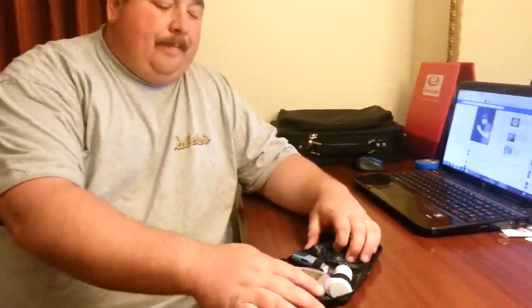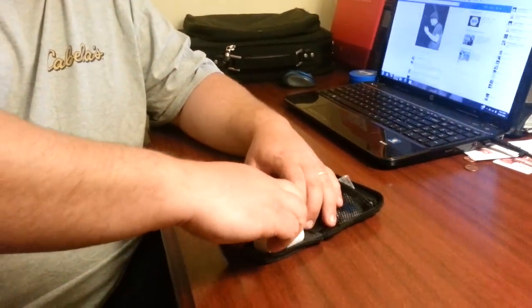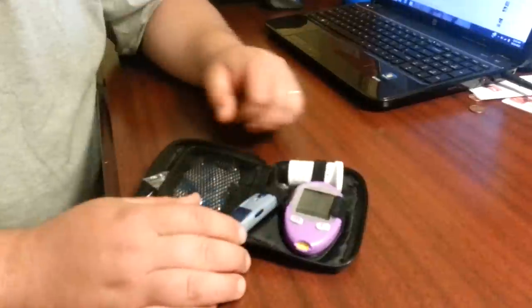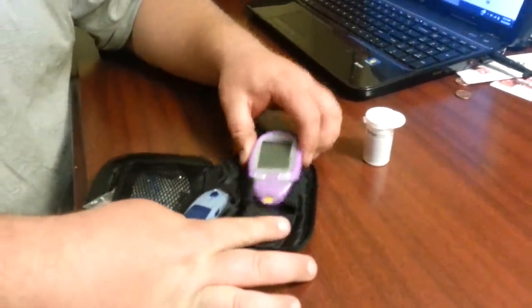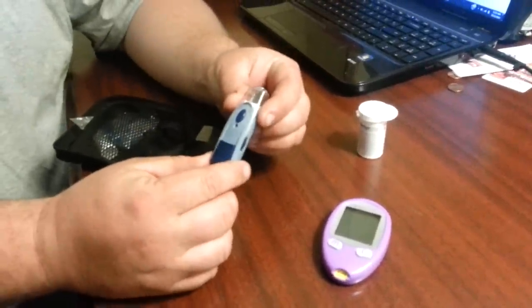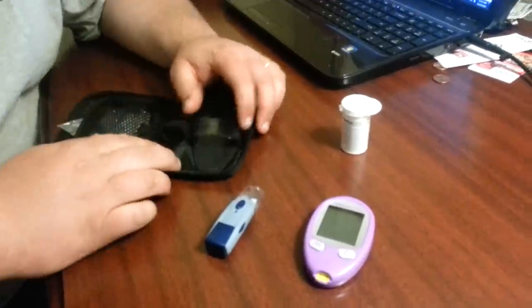What I have here is a little pouch that contains the AlphaTrak 2 that we purchased from Amazon.com. It comes with 25 test strips to get you started and all of this stuff right here. So what you see is: here's your test strips, here's the tester, and here's the device that takes the lancets to help prick your dog's location.